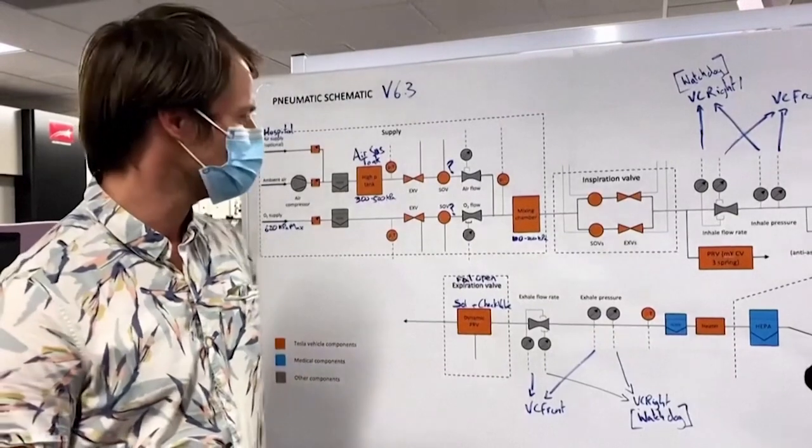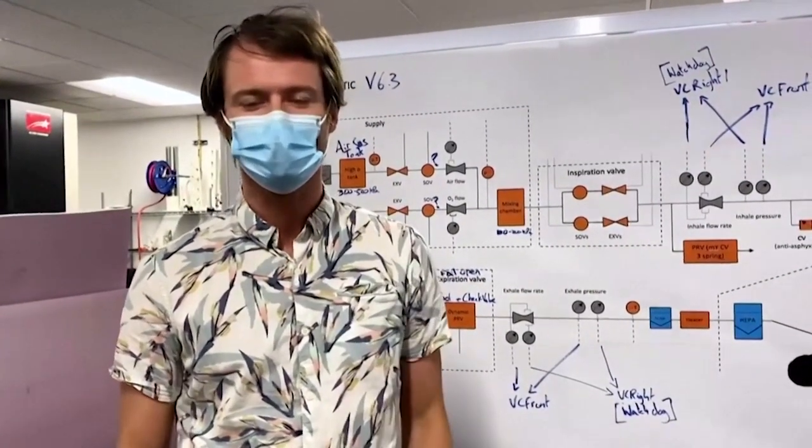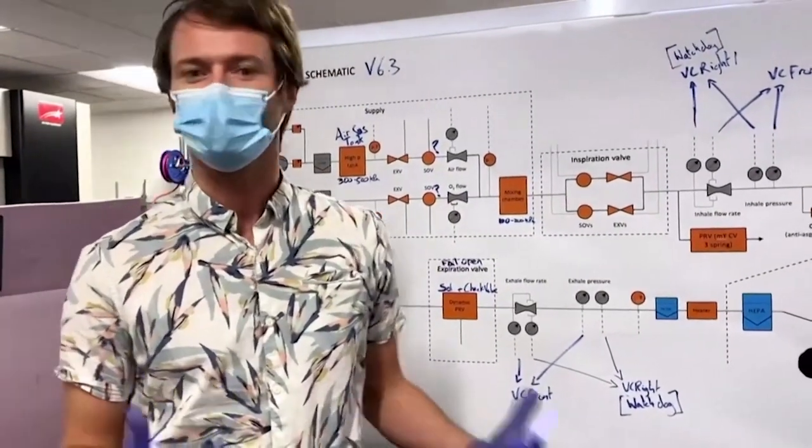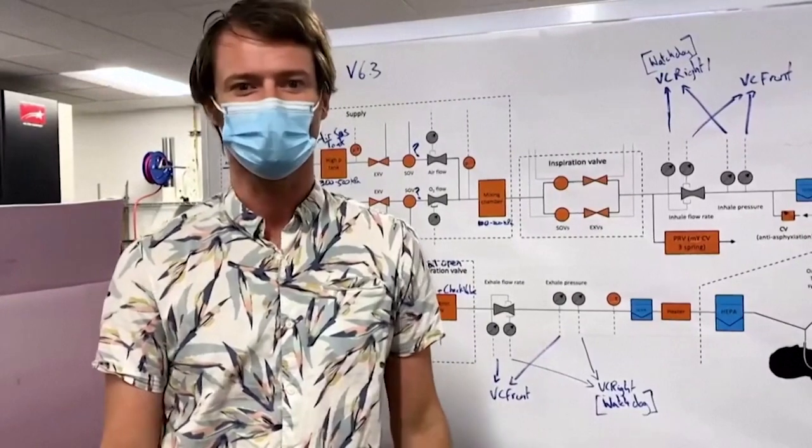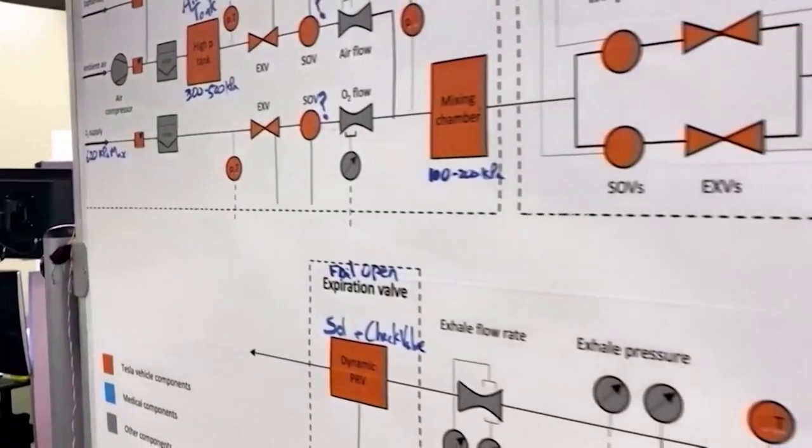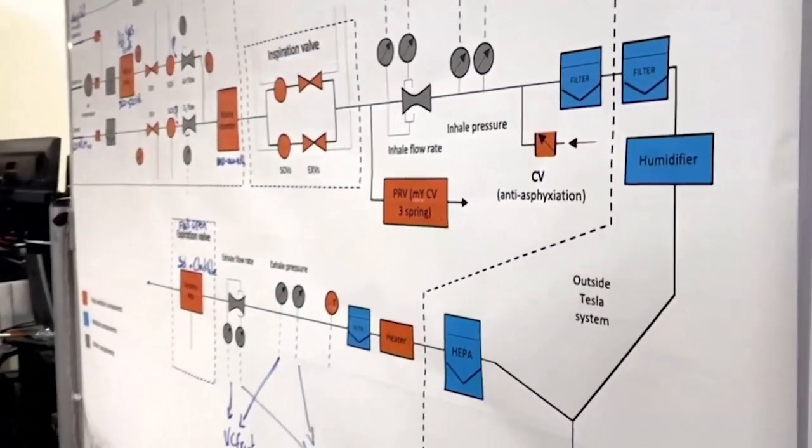We've been working on developing our own ventilator designs, specifically one that's heavily based on Tesla car parts. We want to use parts that we know really well and that we can develop really fast in the available environment. So here's our high-level system design. You can see that all the red dots here are a type of vehicle parts that we've used.